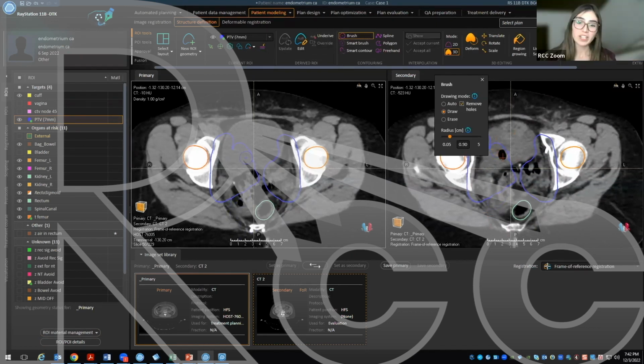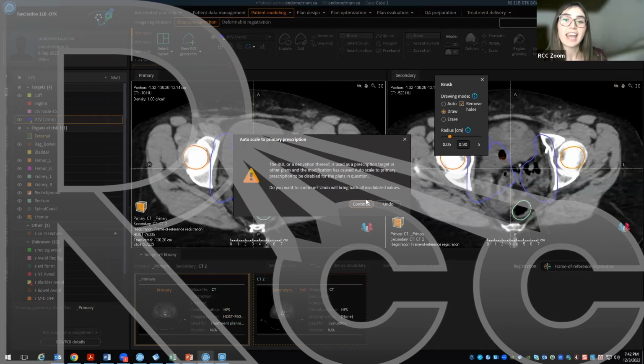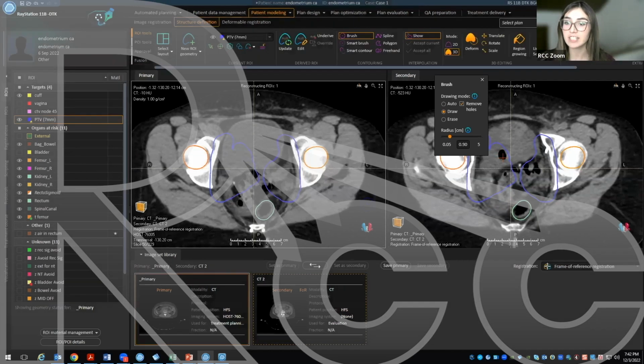We have a great question in the chat. Dr. Jhingran, in this case you mentioned that the images of the full and empty bladder are nearly similar. So can you reduce the margin you give anteriorly or posteriorly to the ITV? Yes.